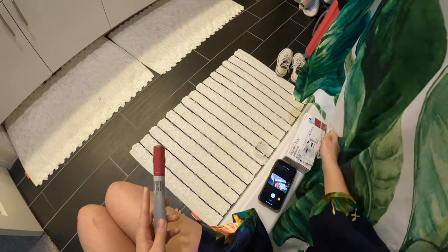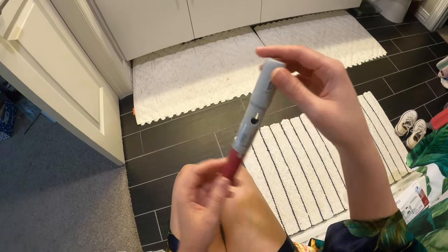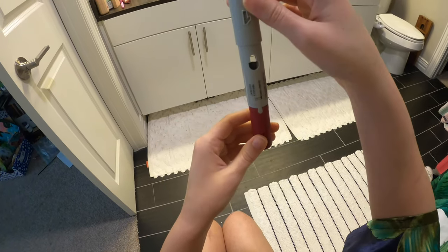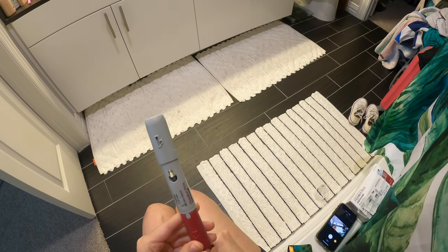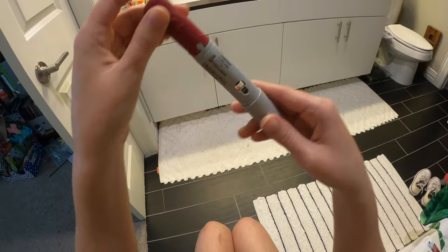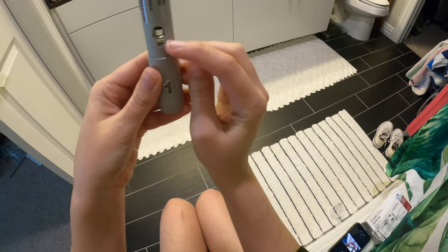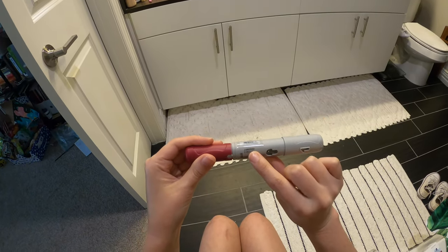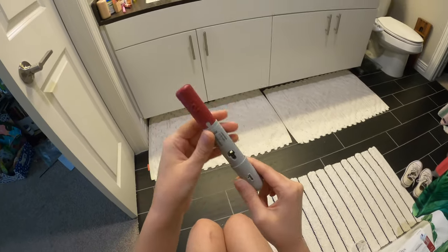I already washed my hands. So you check the medication each time and make sure that — when you're holding it this way — the fluid comes up to this black line. And it does. Then check the expiration date and make sure that the fluid isn't cloudy or anything like that. It looks good.